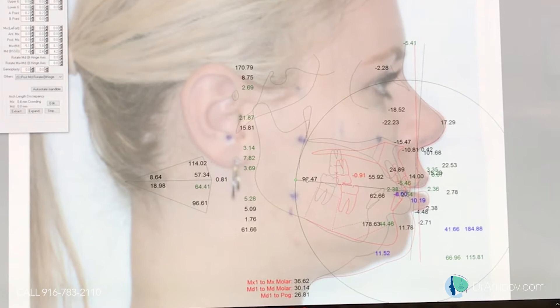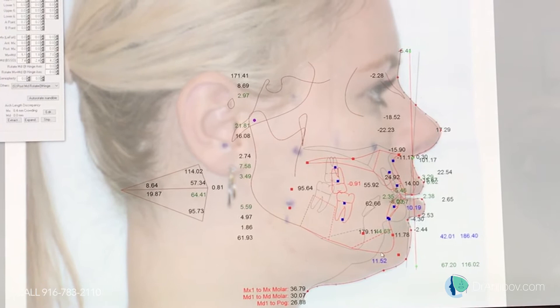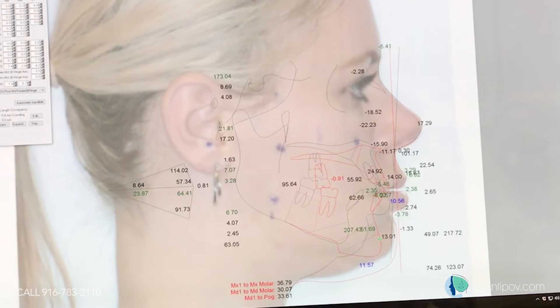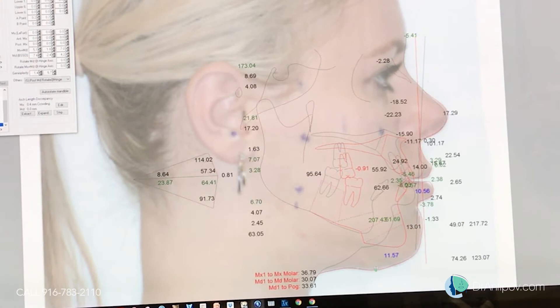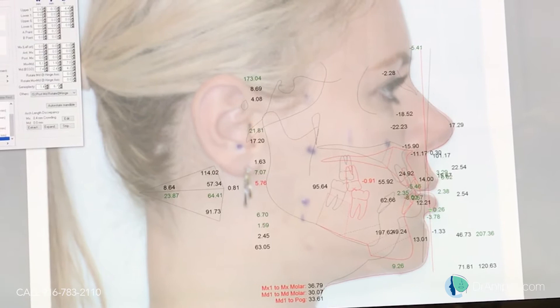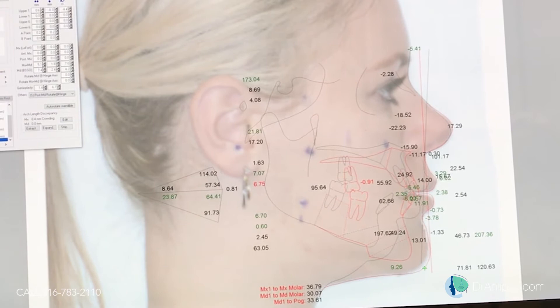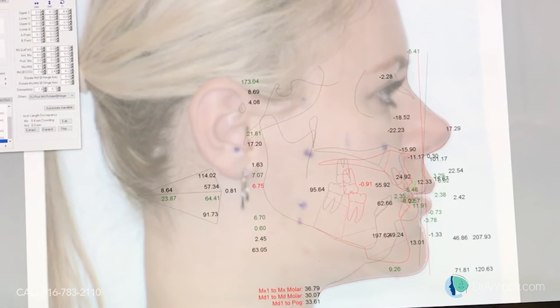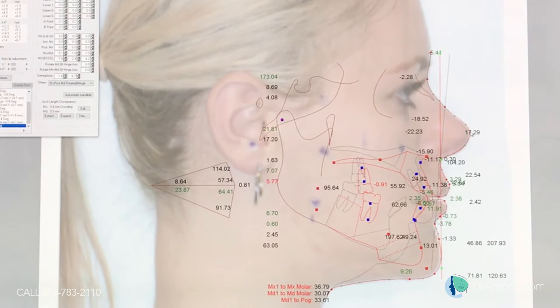That's a lot of movement - 95 degrees. Then we're going to work on the chin, to lengthen the chin.